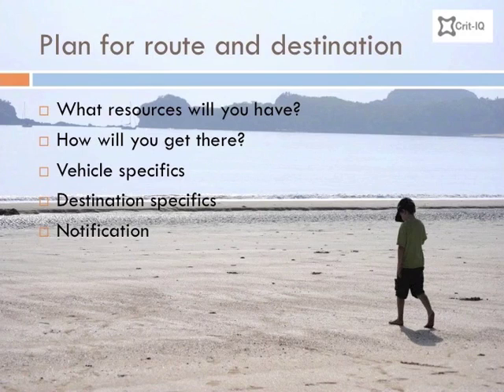Finally, before leaving, ensure that you have let the destination know so that they can prepare for your arrival. Also, notify your colleagues that you are leaving and hand over any responsibilities to them.